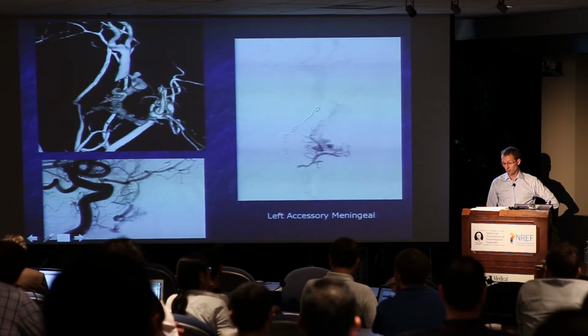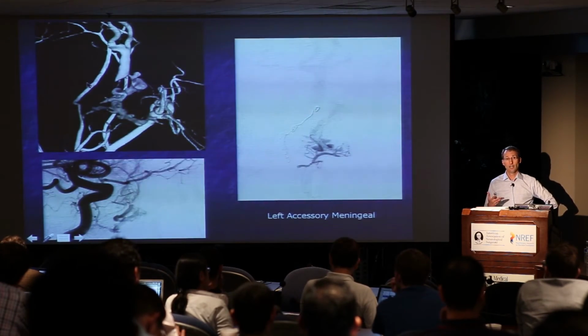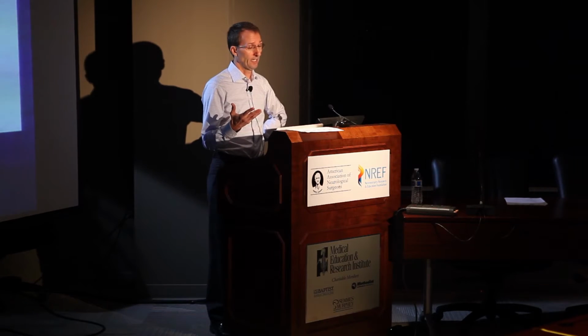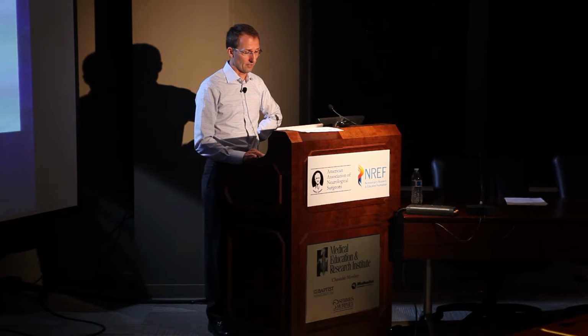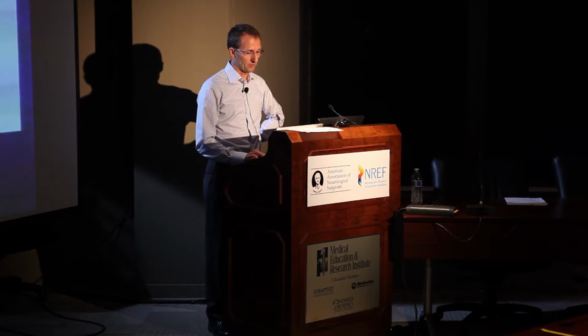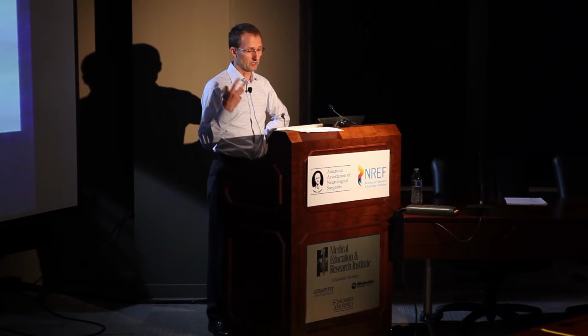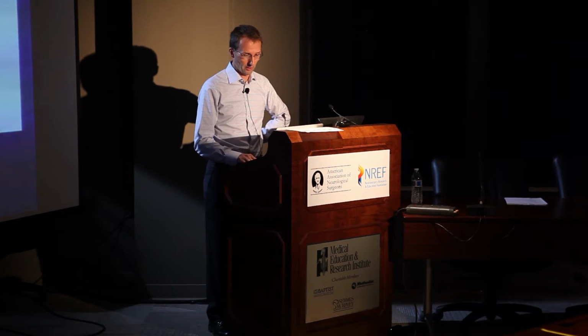We still have to realize that there are collaterals that go back to the meningeal hypophyseal trunk and the ILT, right, into the cavernous sinus. We have to avoid that. We know this guy is coming downstream, and we could easily retrograde embolize onyx directly into the internal carotid. So you just have to be aware of all these things before you start.